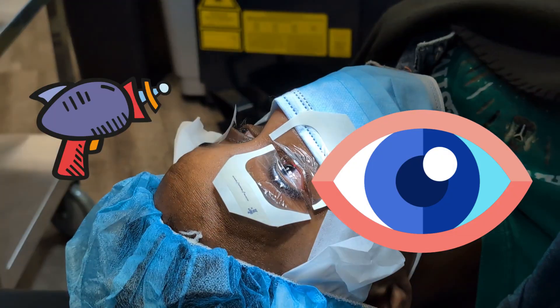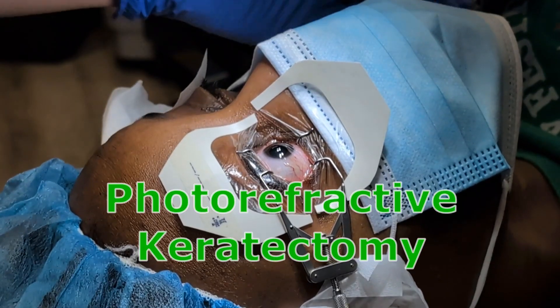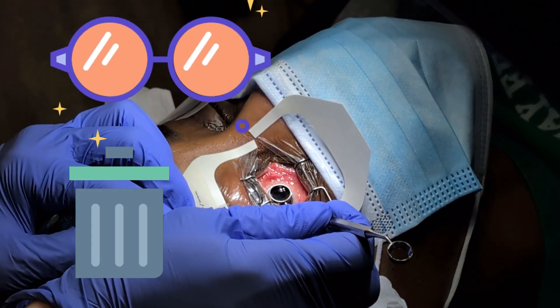This eye is about to get lasered. This is PRK. This patient has chosen photorefractive keratectomy because she doesn't want to deal with glasses anymore. I'm going to show you the whole procedure from start to finish.